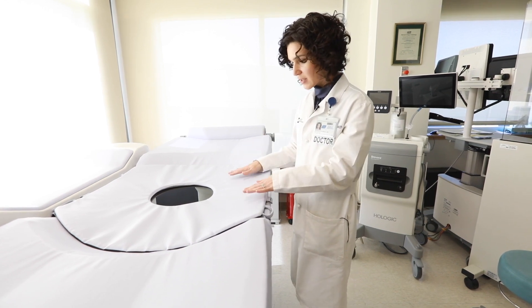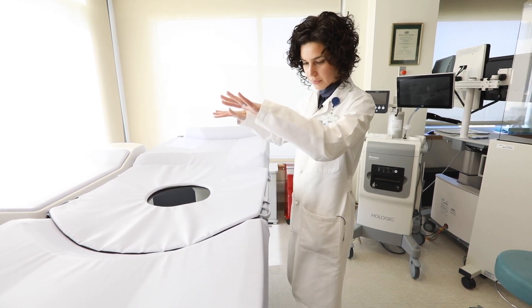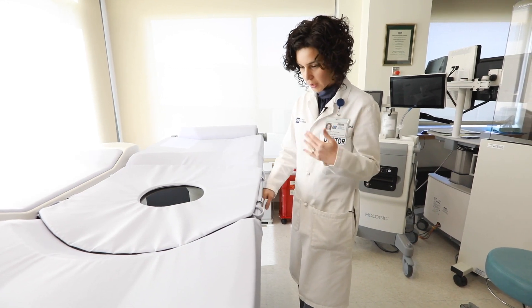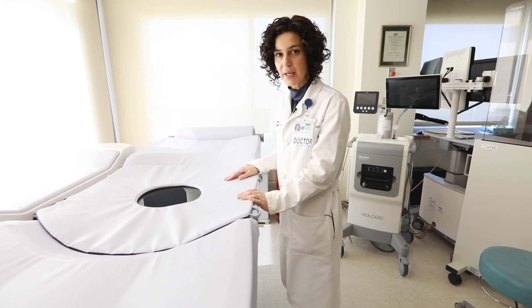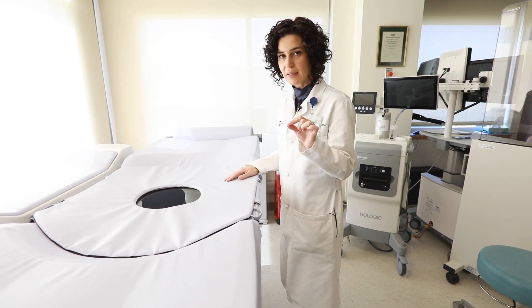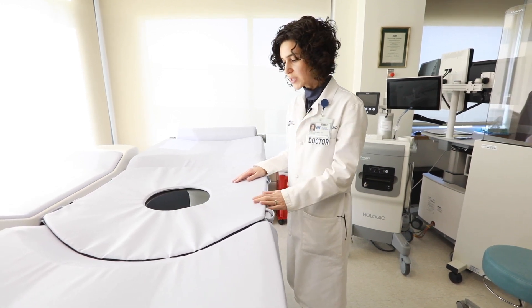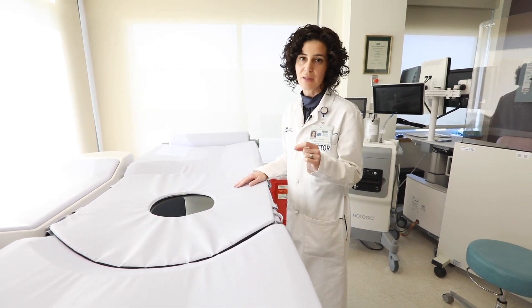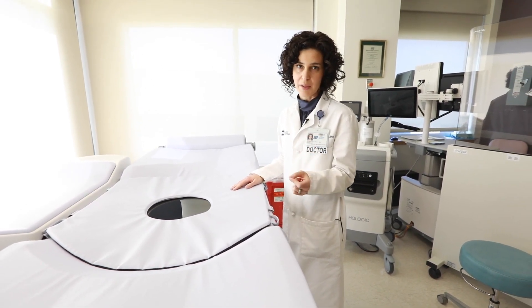Once you're in position, the table will move up with you and I, or another radiologist, would be under the table working. We would numb the skin, numb deeper in, and once you're nice and numb, make a tiny little nick in the skin. Through that, we take a few small threads of tissue and leave a tissue marker in place to mark the area where we performed the biopsy.